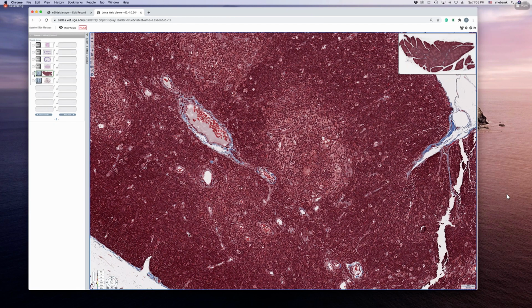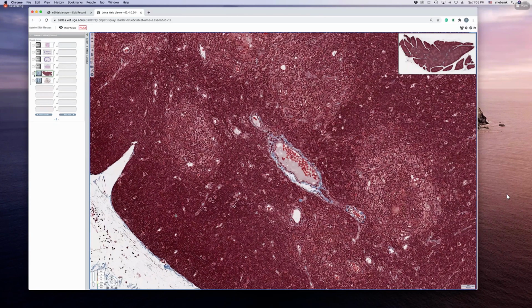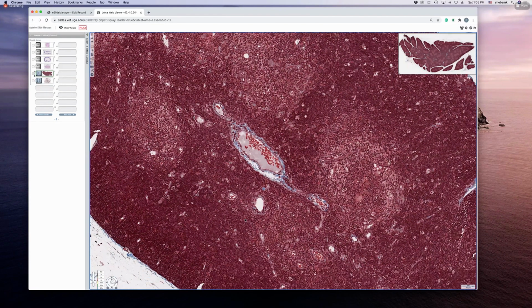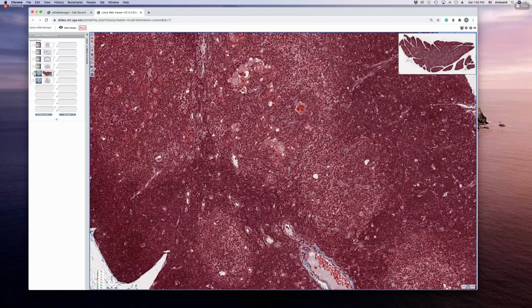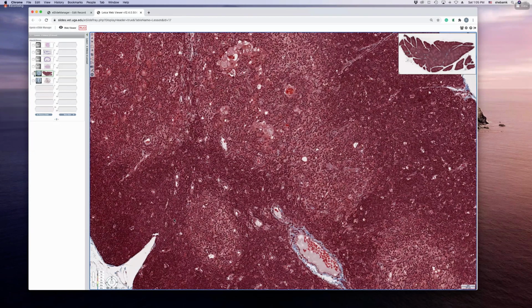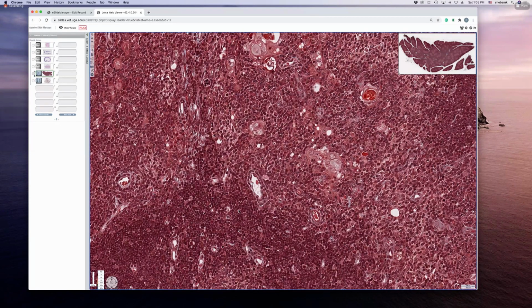Okay, so T cells come here from the bone marrow and they reside in the thymus, and there we call them thymocytes. They undergo maturation and then they get back into the circulation. When they are sitting here in the thymus, all these are lymphocytes or thymocytes. You see lots of them.